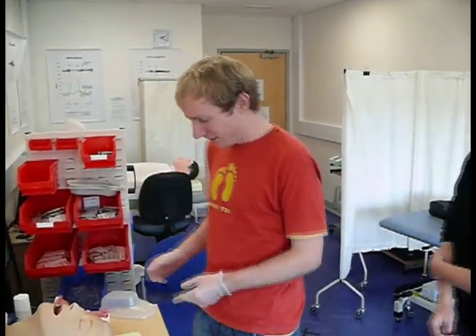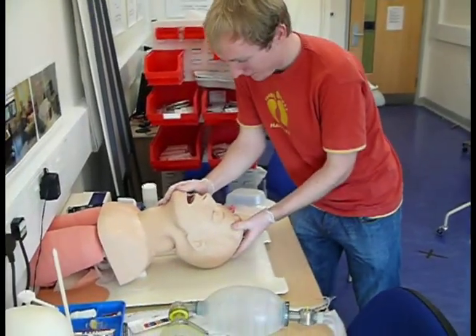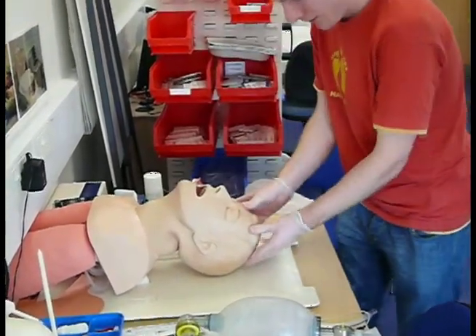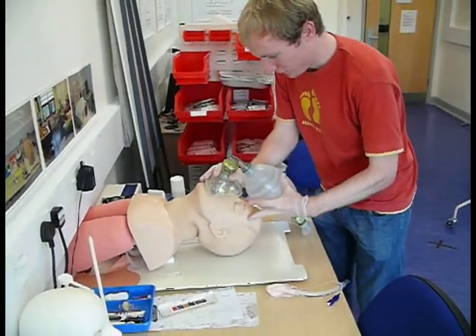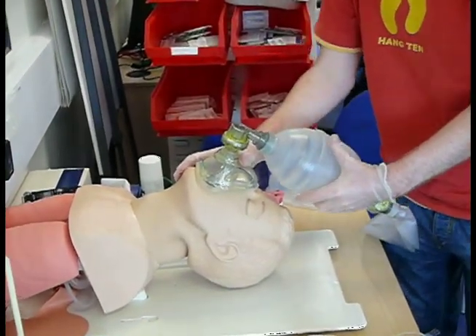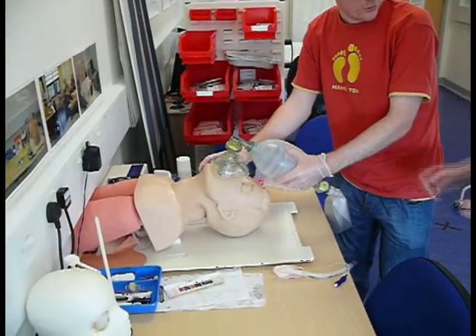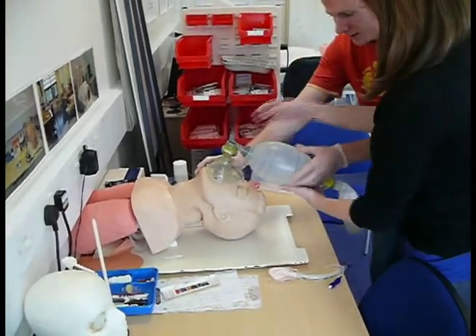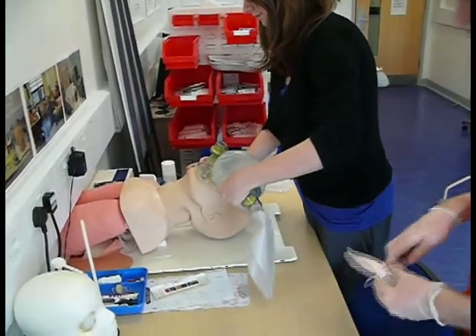What I'm going to do is a head tilt chin lift on this patient and then get the bag and mask and use it to keep air going into the patient's lungs. What I want you to do is take over doing this from me whilst I prepare the equipment to insert the laryngeal mask, and do one breath every six seconds.